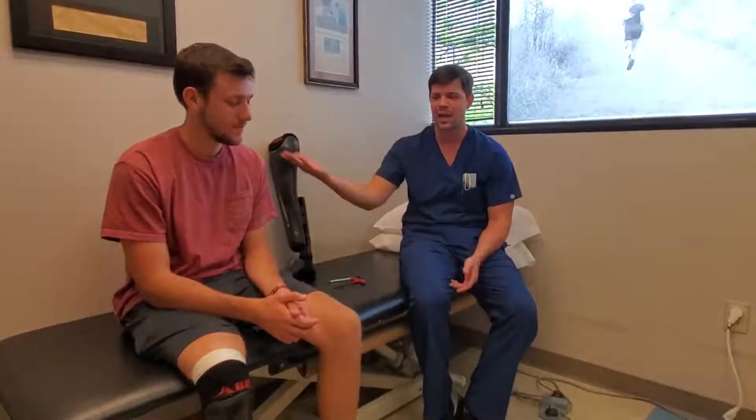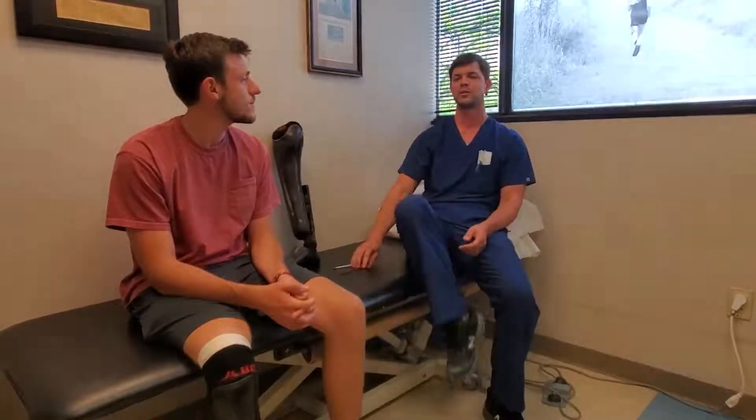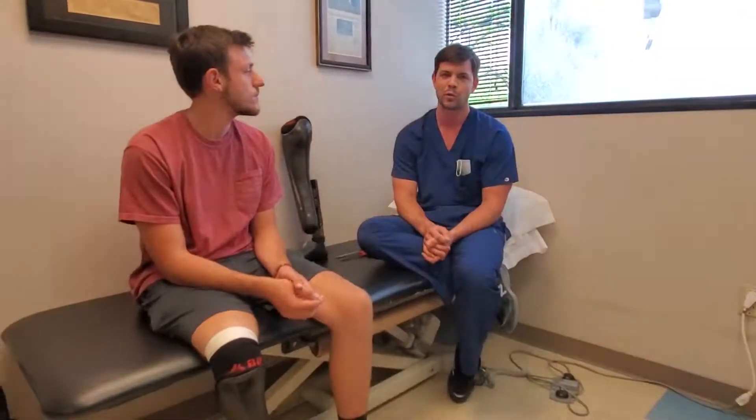Hello, this is Justin with ABR. We have Alex Klein in town from Louisiana. He's a long-term patient of ours — he's come up for a tune-up on the current fit and function of his prosthesis. He's been wearing a leg for twelve years now, so he was one of the original ABR patients we had the opportunity to work with.